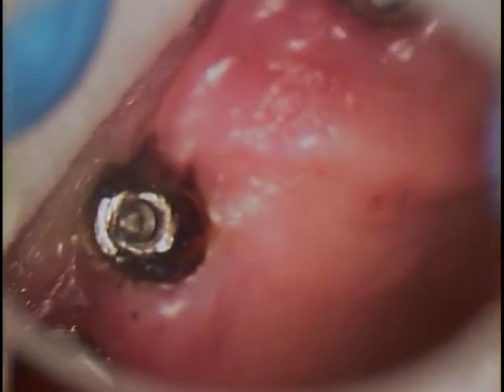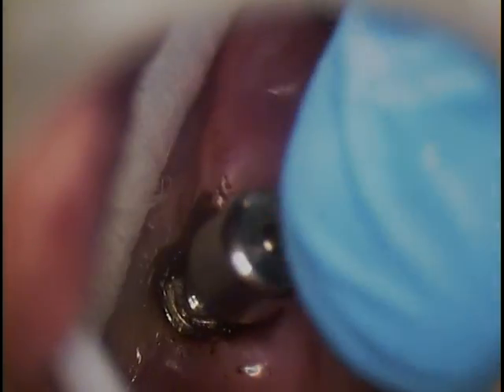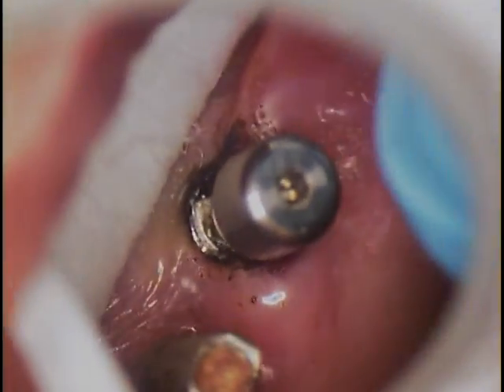Let's see if I can put a healing abutment. I only have one of these available. This is an external hex, not an internal. I think this is a little too big of a thread. That's a different thread shape. Let's see if there's anything else I can put in there that would help the cause. Even if we left the screw in there, it would be fine.